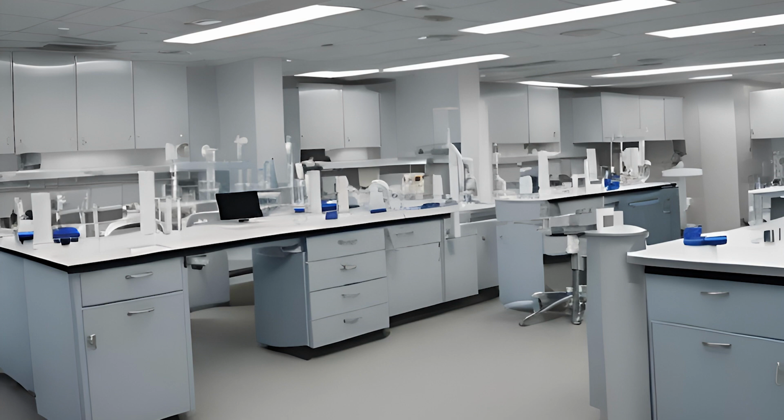After you've verified any dietary restrictions, you're also going to verify allergies. If you might have to use iodine, you've got to make sure that your patient's not allergic to shellfish. If your facility uses latex, you have to ask if they're allergic to latex. If your facility doesn't have any latex use, you still need to ask if your patient has any allergies which may be of concern.